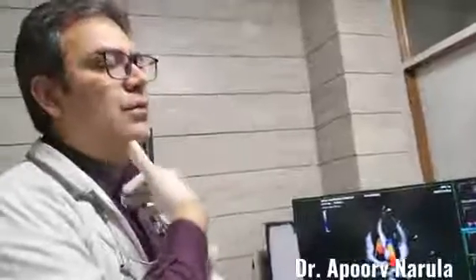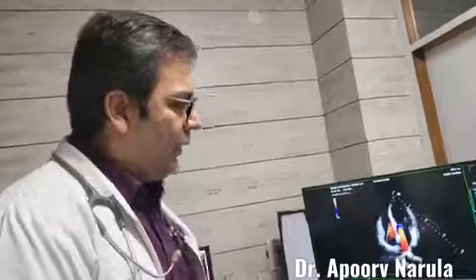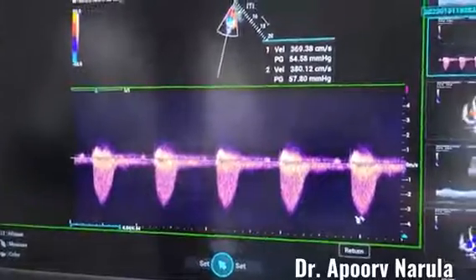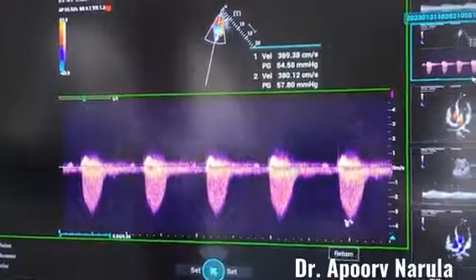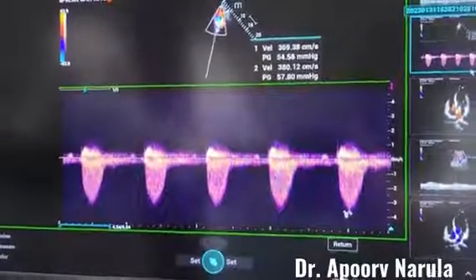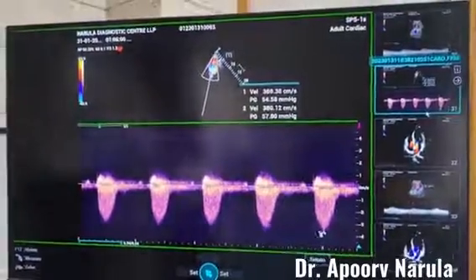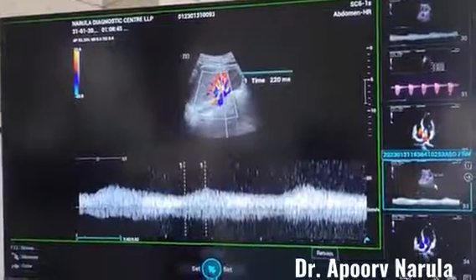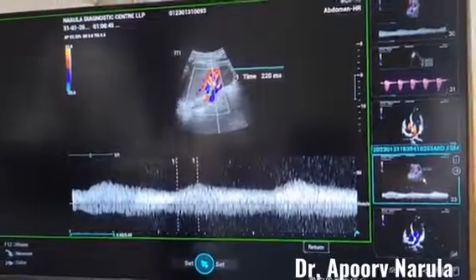But then after completing all these views, I went up with my last view of the aortic arch view — never to miss that view. And this is what I found: the velocities across the aortic arch were increased. It was 3.8 meters per second, or 380 centimeters per second, with a gradient of 57.80 mmHg, which was suggestive of some narrowing or obstruction at the level of the aortic arch. So I went down to see the flow distal to it in the renal arteries, where I saw a dampened flow, or a tardus parvus kind of waveform, in the renal arteries.